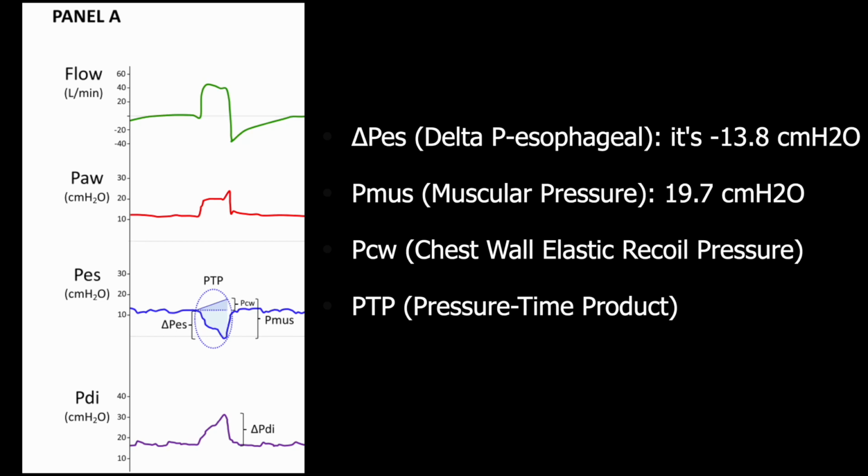Just to summarize all things that I've told with this example, it will be easier to understand. So this is a standard respiratory effort of a patient on the ventilator. Here, first we will discuss the invasive one, where we have the esophageal pressure. And the gastric pressure is not shown here, but we find the transdiaphragmatic pressure, the difference.